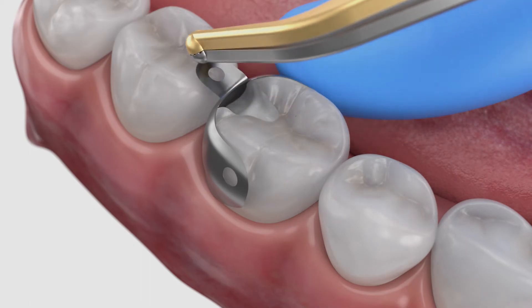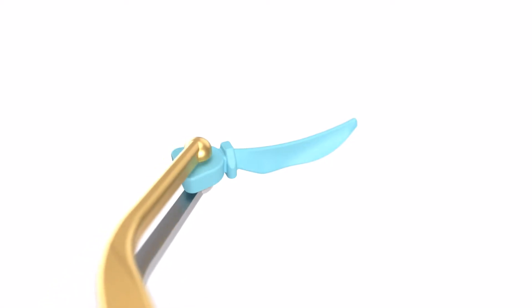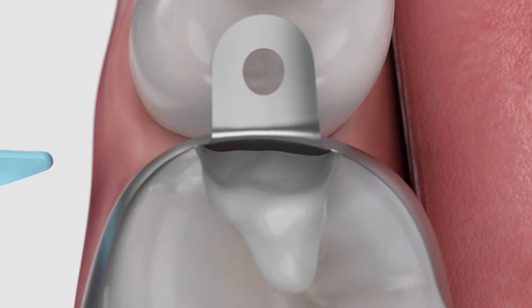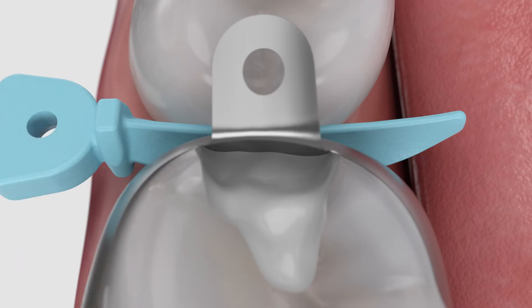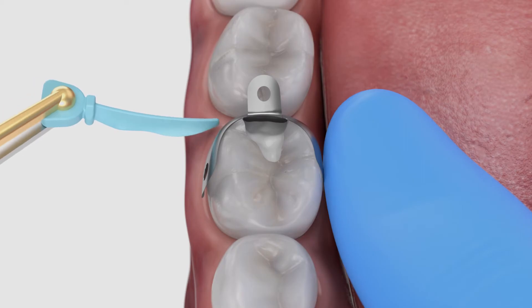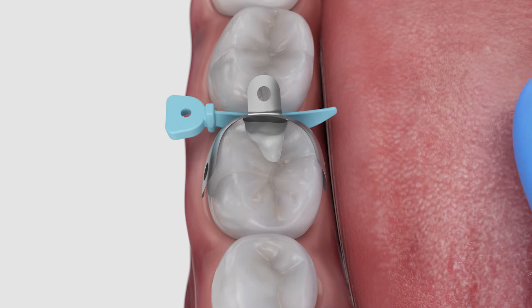Using the pin tweezers, bend the tab to make placement easier. Next, grip the hole at the end of the Wedge. The adaptive self-guiding Wedge facilitates easy placement by actually depressing gingival tissues and minimizing soft tissue trauma. During placement, trap the matrix tab against the adjacent tooth with finger pressure to prevent it from slipping as the Wedge is placed.